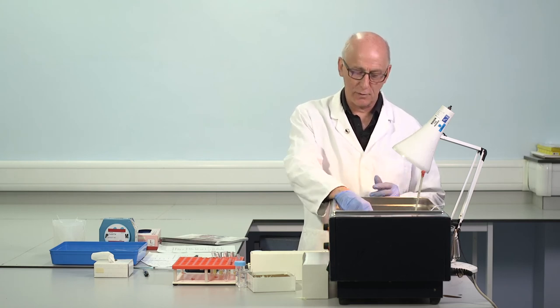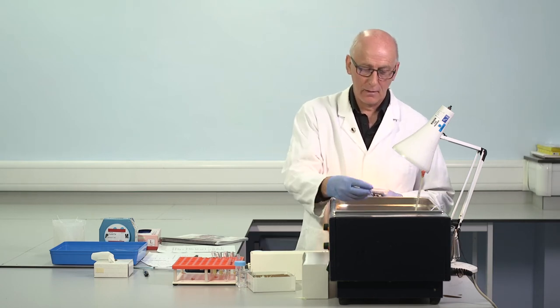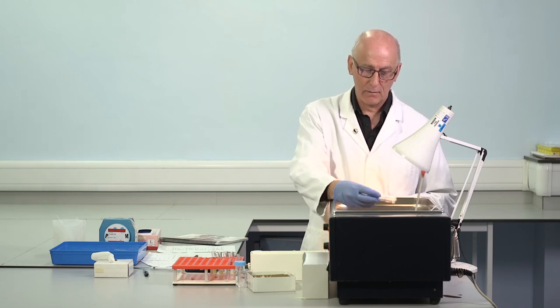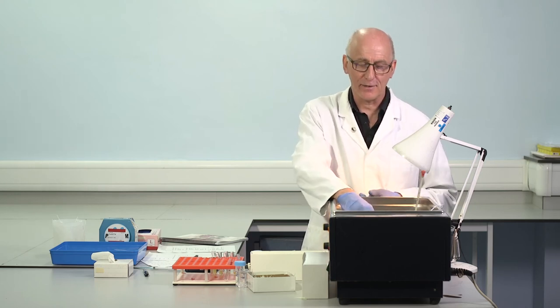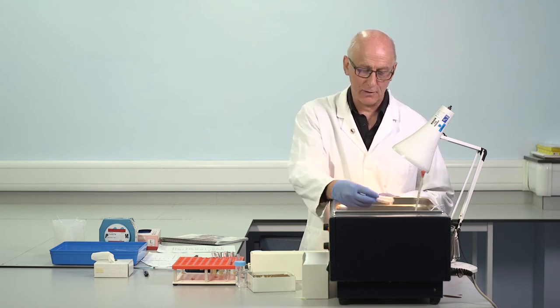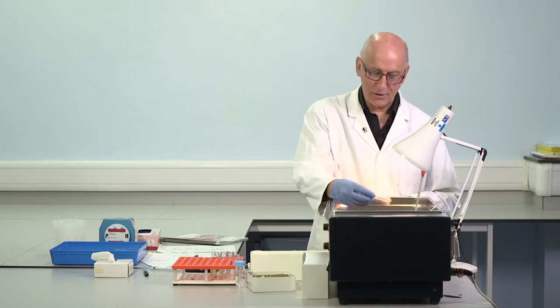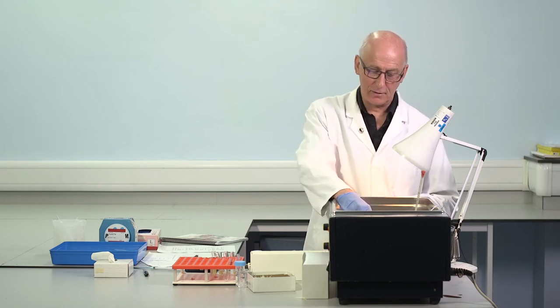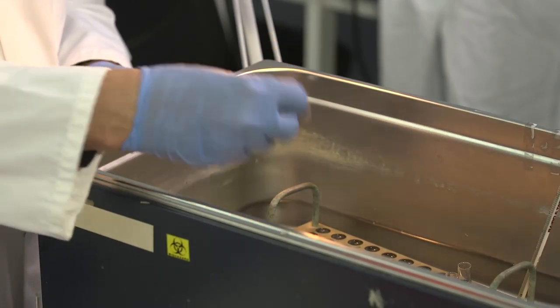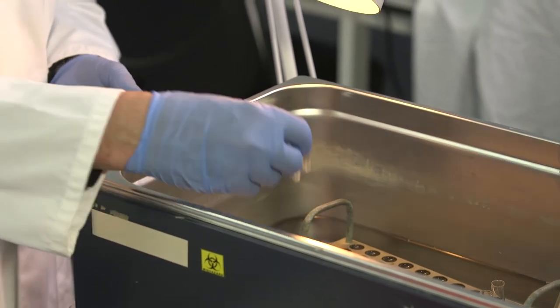And so often it's a compromise when a manufacturer constructs a reagent. It's a compromise between what would be ideal for detection of mild haemophilia, what would be ideal for detection of lupus anticoagulant, for monitoring unfractionated heparin, and it's not the same. So we're very frequently working with a compromised situation. And for whatever reason, the composition and concentration of phospholipids in these reagents are very, very different, extremely different. And this has an important impact on the results, depending on the defect.